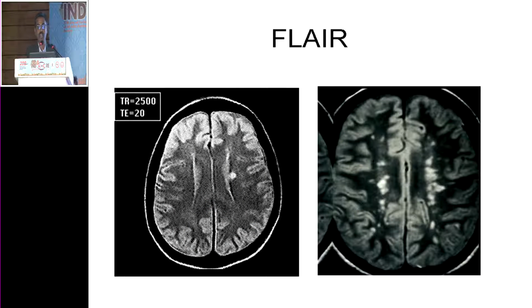So the next most important thing is the FLAIR images, fluid attenuated inversion recovery sequence. So what is this fluid attenuation? Discussing the T1 and T2, T1 is used for normal anatomy and T2 is used for pathology. So good pathology is seen in T2 images. But what happens here, if in T2 the fluid and the CSF is very bright and we want to see something like a bright plaque in multiple sclerosis in T2. So this is a FLAIR image, and supposing this fluid, this CSF was very bright here, we will not be able to appreciate the multiple sclerosis plaques in T2.